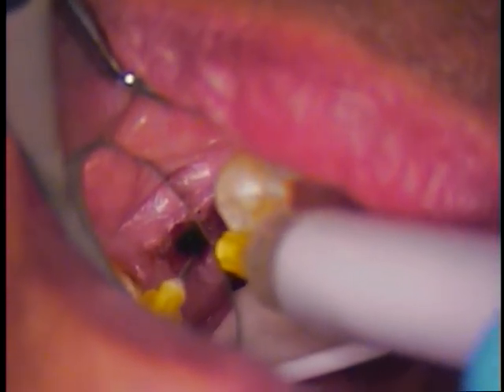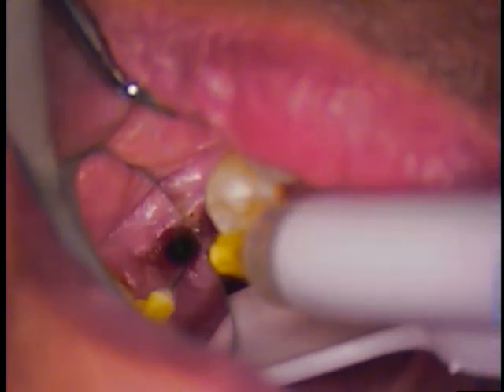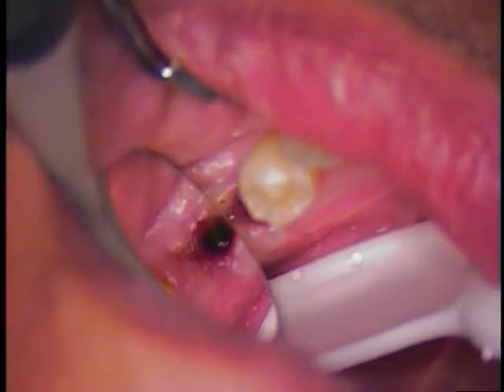Okay. So it looks like some kind of metal filings all the way down. Now that, I don't know why we would see that, but that's what it looks like. There's the base of the implant, and there are the threads we have to clean. And what a cleanup it has. There's a mess down in there. So let's clean it up.